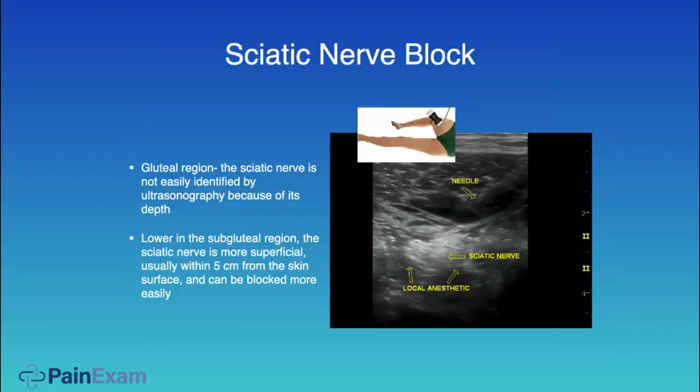So when performing a sciatic nerve block, I have the patients positioned as such, where their hip and their knee is flexed, in the decubitus position. And us pain doctors have the luxury of being able to get in the general vicinity of the nerve and get some relief. Whereas the anesthesiologist, if you're doing a sciatic nerve block, you really need to do a good job of getting that local around the nerve to get a dense block, or the surgeon's going to start and the patient is going to complain.